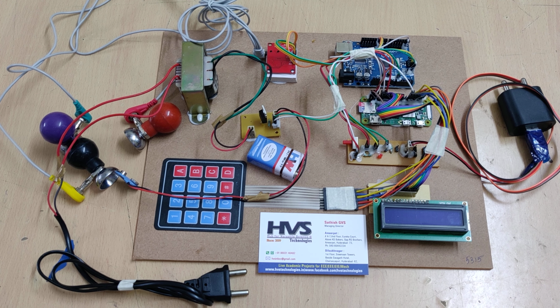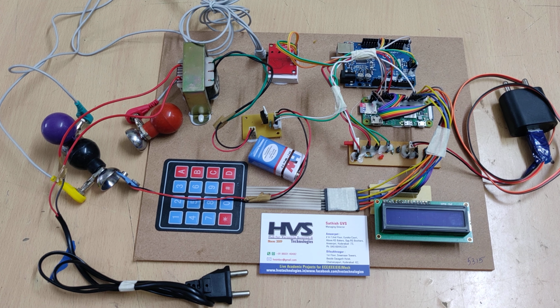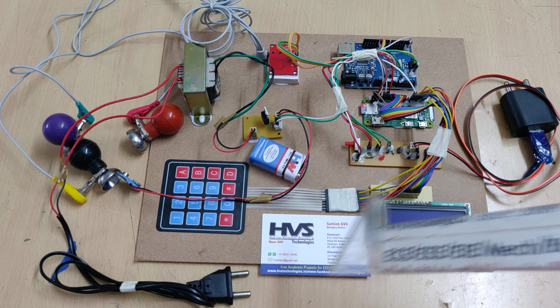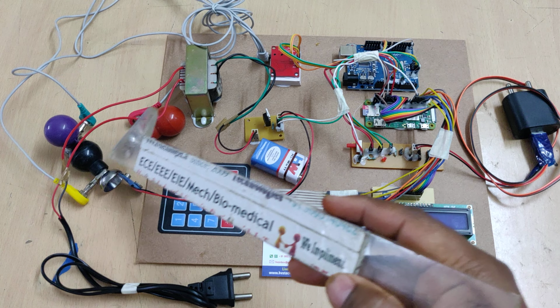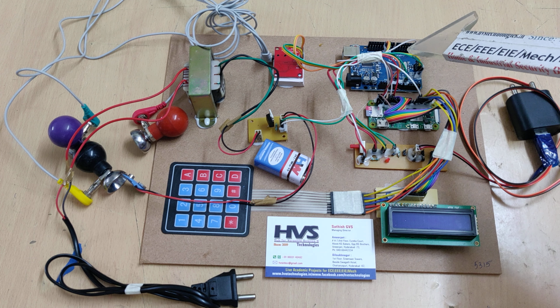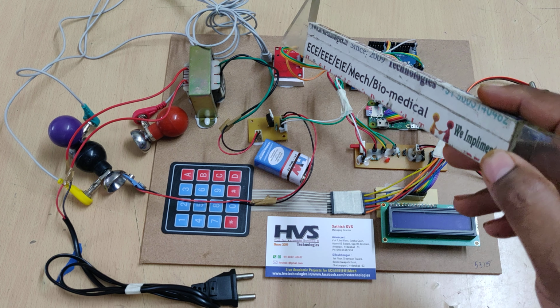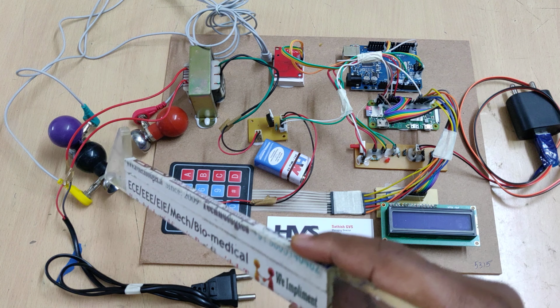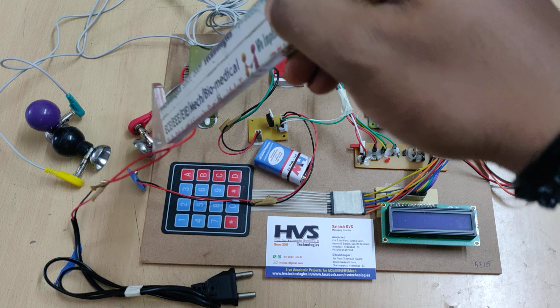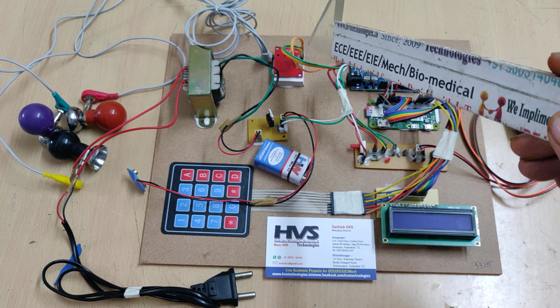Welcome to the project demonstration of arrhythmia disease detection using the Raspberry Pi Zero 2 W. We have interfaced the ECG sensor module to the Raspberry Pi board by using an Arduino UNO. Here we are using the AD8232 ECG module, which takes the electrode inputs from these three electrodes, and the data will be analyzed and converted into analog data.